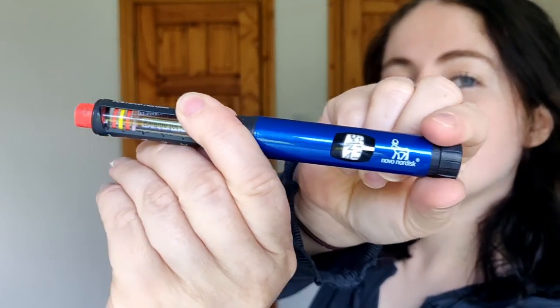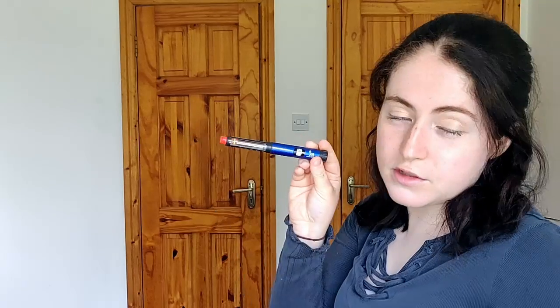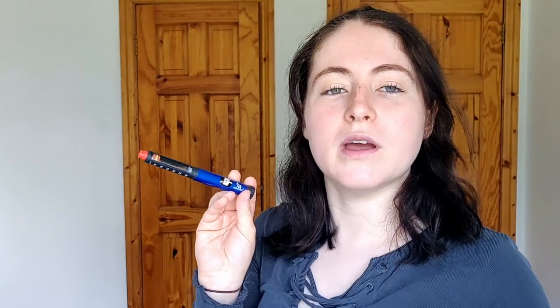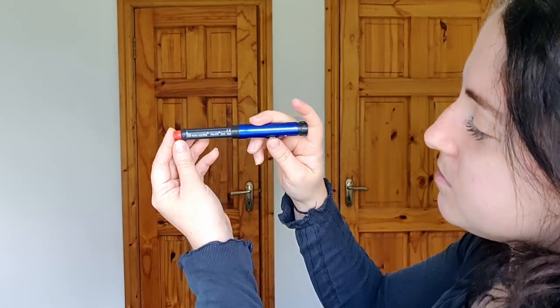Also, you can hear the clicks on the Novo pen 4. However, this pen doesn't do half doses. Novo pen 3, 4, 5, and 6 all only do single units. Anything in between — like the Demi, the Junior, the Echo, or the Echo Plus — are the half-dose pens. So bear that in mind if you're looking at an insulin pen.